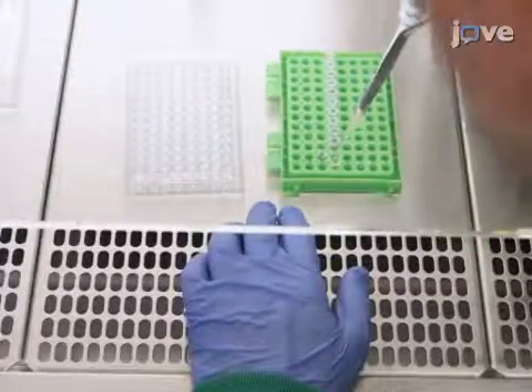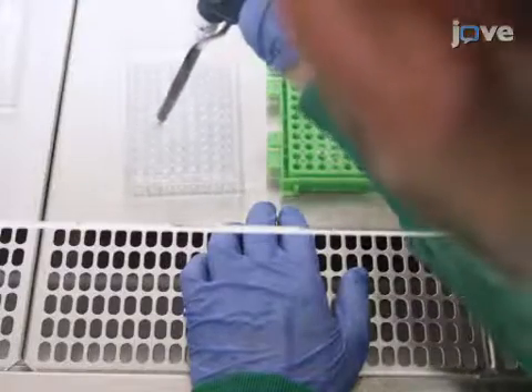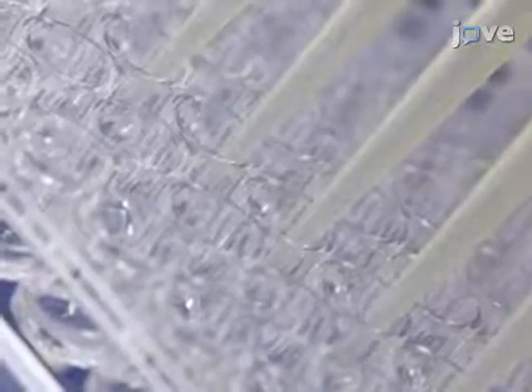Add 25 microliters of the appropriate antiserum to the first well of the 11th row as a positive control. Then transfer 25 microliters from the first well of each row to their successive wells to perform serial two-fold dilutions.